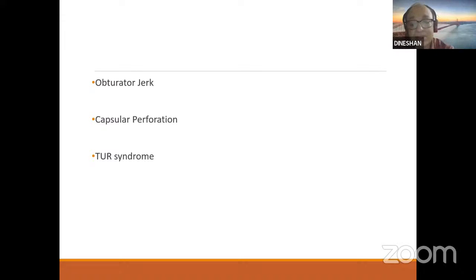If it goes undetected, then you have the patient going in for florid TUR syndrome. The patient will usually start with yawning, disorientation, restlessness, abdominal distension, pain in the hypogastrium.